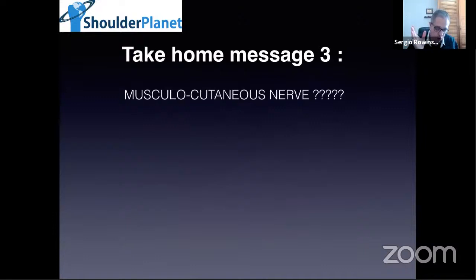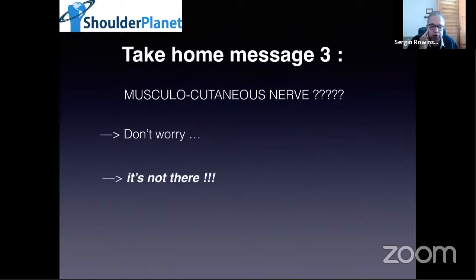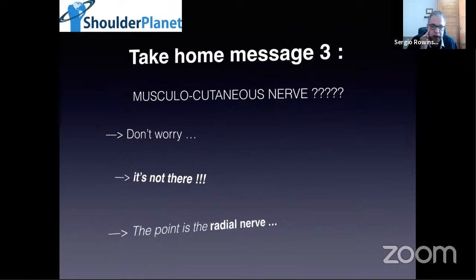In the technique I use, don't worry about the musculocutaneous nerve. It's not there in the distal incision because I do it much more laterally. The problem is the radial nerve.